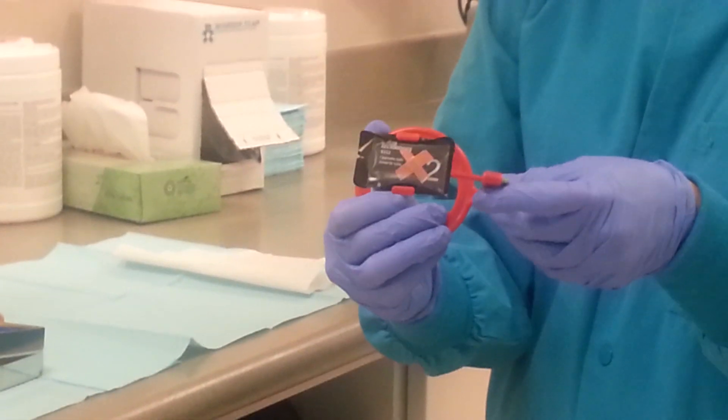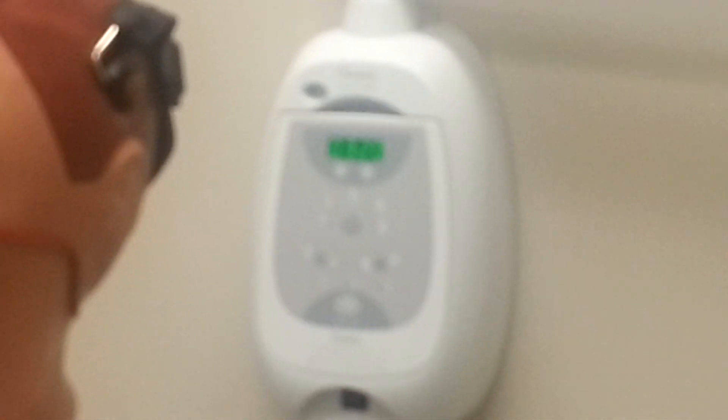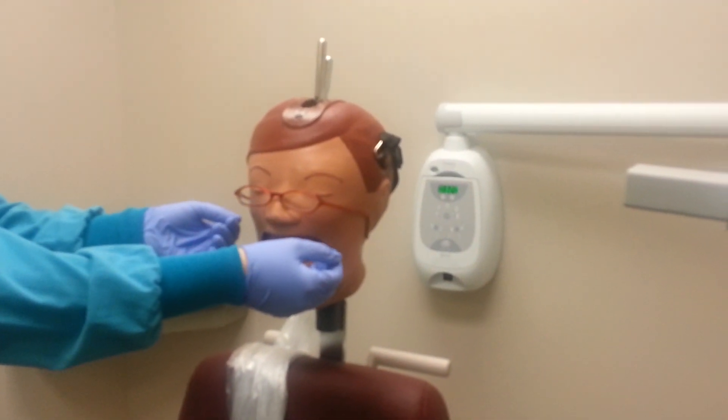Before taking any radiograph, be sure the X-ray unit is on and set to the correct setting. We will use the adult setting and the bitewing setting. Make sure you ask the patient to remove any items that may interfere with the exposure, such as glasses or jewelry.